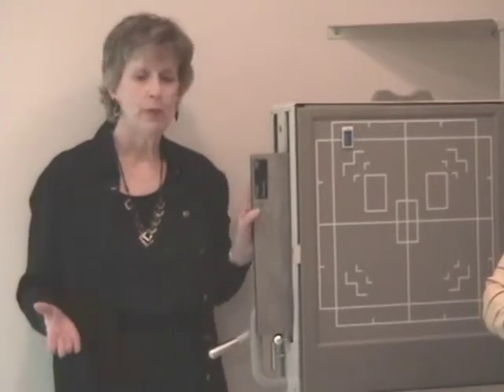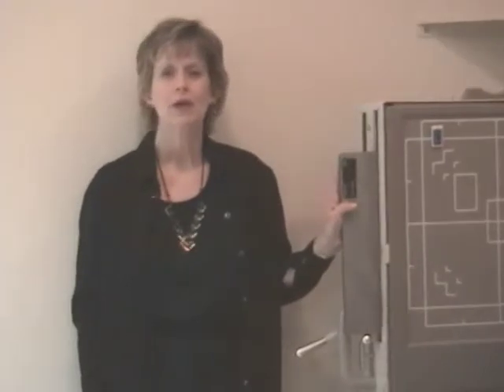A female patient who's 400 pounds, your gut reaction is they're not going to fit on the 14 by 17 film either. But they're not athletically built. They're obese. It's adipose tissue. Adipose will actually take the lung fields and compress them. The lung fields are actually smaller on somebody who is obese due to extra calories rather than large from athleticism. Okay? So don't let an obese patient change your mind.